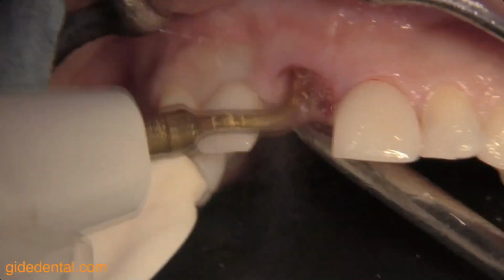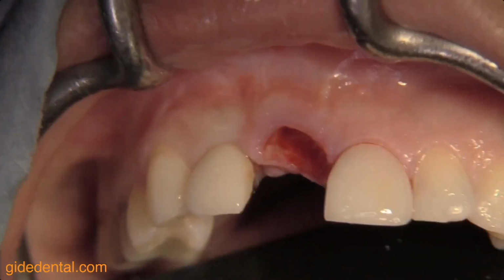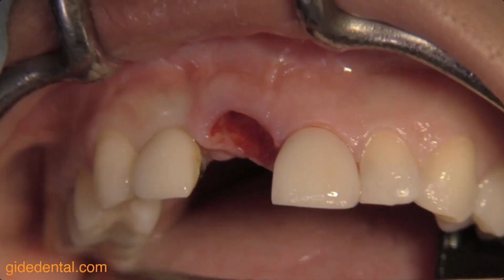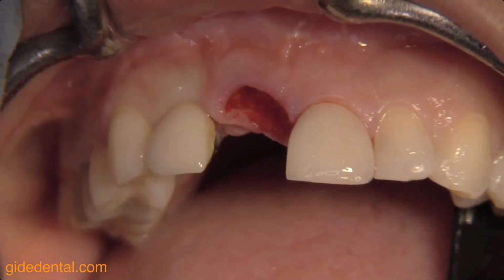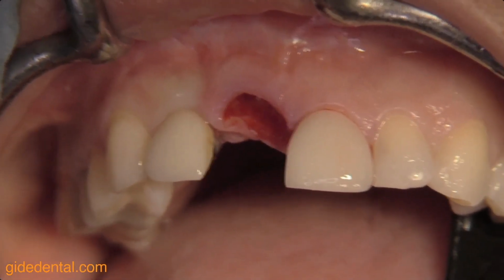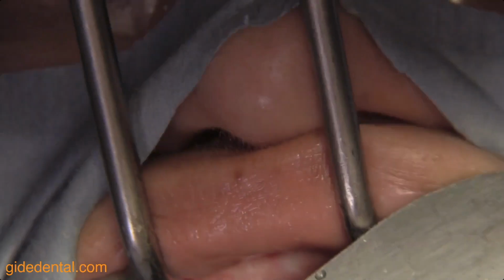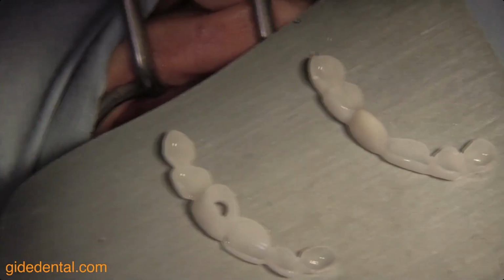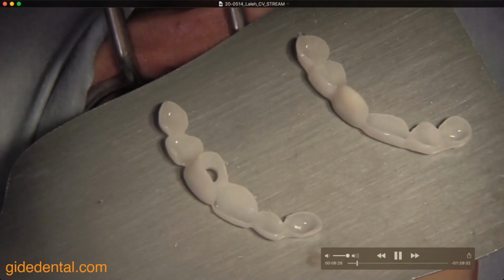So what I'm doing here is removing, again, any inflammation tissue, removing any soft tissue, and removing any kind of periodontal ligament tissue. And of course, I do this with a round diamond, and this will help me to clean it out.